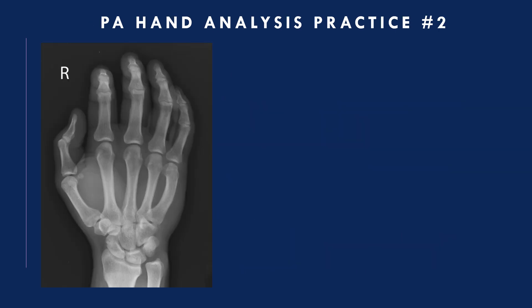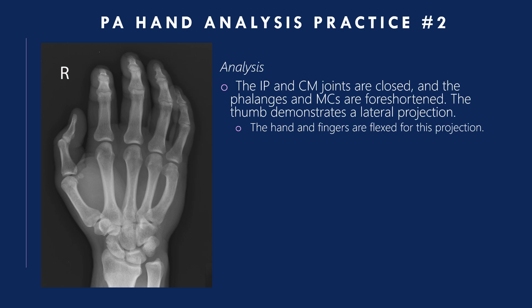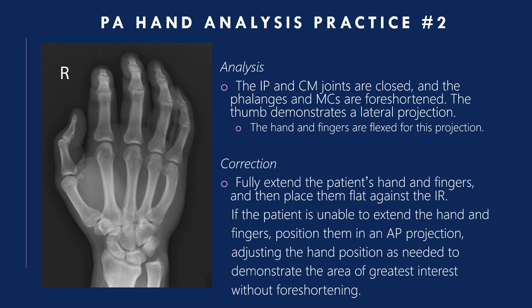PA hand analysis practice two: the IP and CM joints are closed and the phalanges and metacarpals are foreshortened. The thumb demonstrates a lateral projection — the hand and fingers were flexed. Correction: fully extend the patient's hand and fingers and place them against the IR. If unable, position them in an AP, adjusting hand position as needed to demonstrate the area of greatest interest without foreshortening.